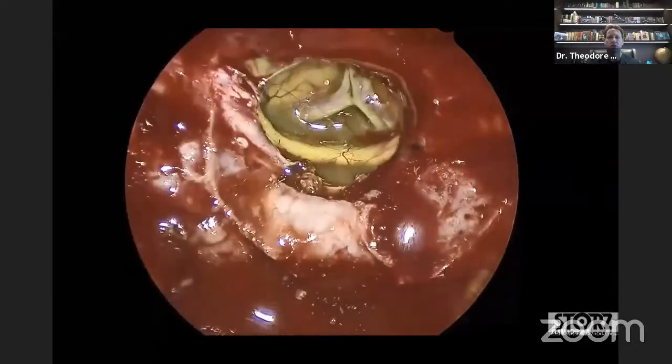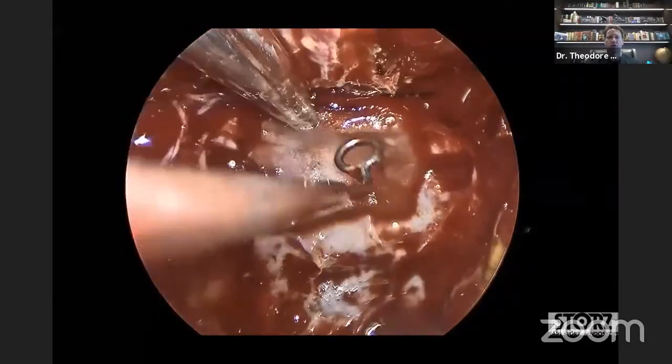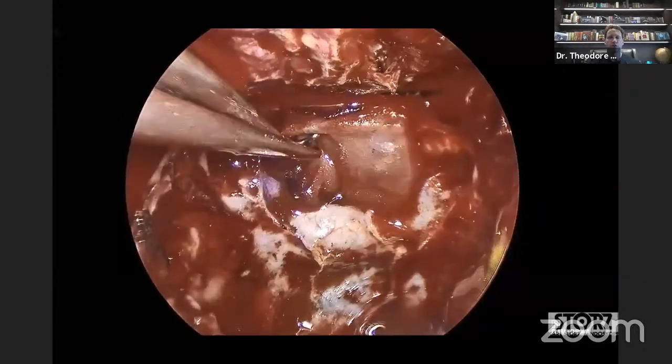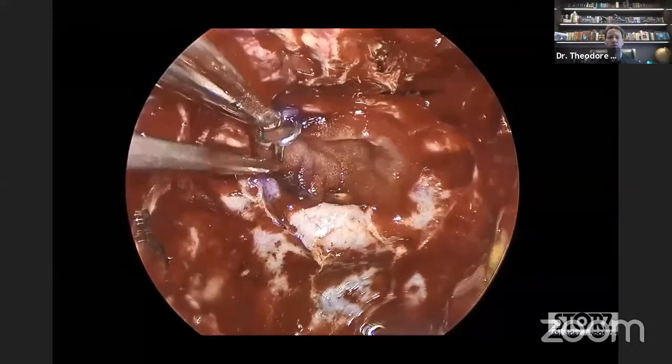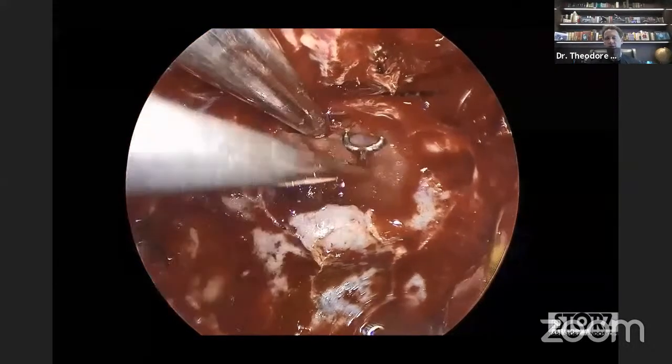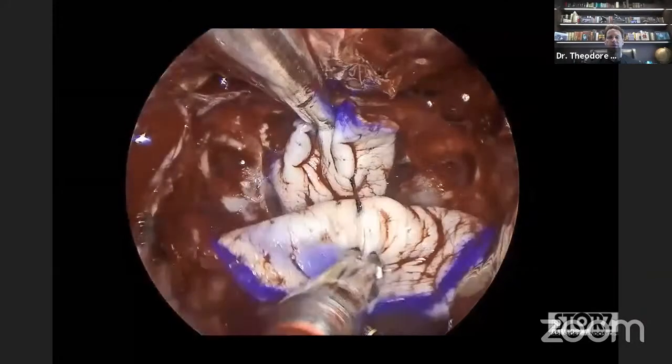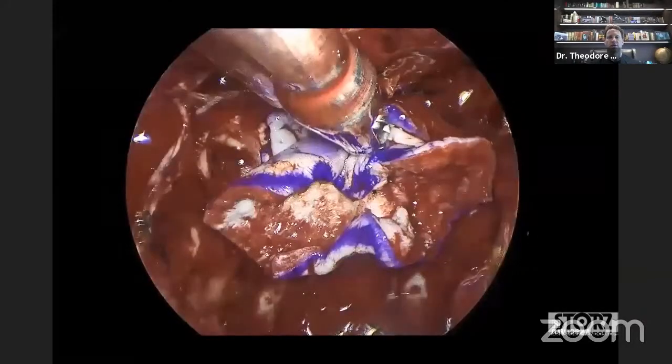Here we're taking out a meningioma. We put an inlay of Duraform. We've been using this closure a little bit more because it seems to work well. It's a soft closure, so there's no risk of pinching anything with the Medpor. And you take two pieces of alloderm. You don't even have to use fascia lata, so you can save the patient a thigh incision. And you tie them together.